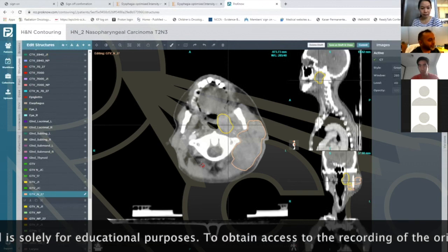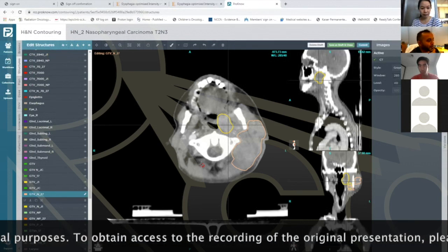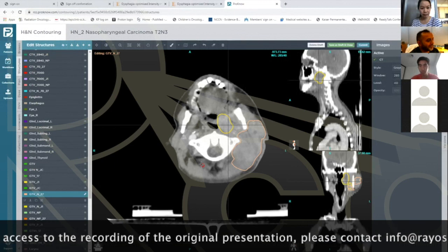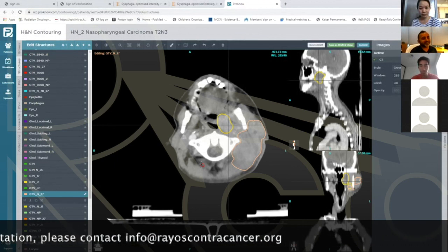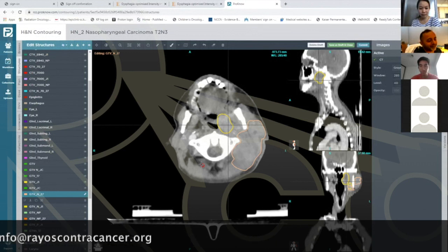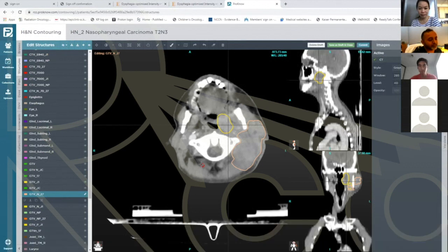So I see the follow-up question. If you've got induction chemo, would you treat the pre-chemo GTV or CTV or the post-chemo volumes? That's a great question. So I think for the nodes, it's very easy. For 70 gray, I would only treat whatever the residual gross nodal disease there is to 70 gray. I would make sure that I treat wherever there was initially involved nodal disease in my high-risk nodal CTV, so meaning that volume would all get 60 gray at least.